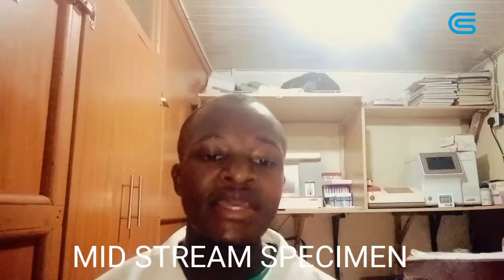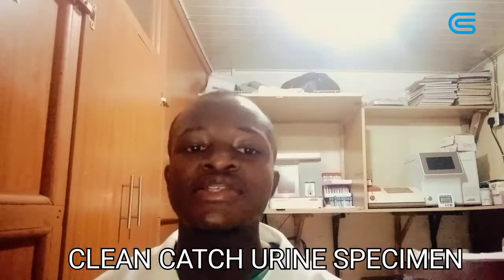So we have the midstream specimen. This is a specimen obtained from the middle part of the first urine. So you urinate first, you stop, you obtain the sample, then you finish. So it will be called midstream urine specimen. It is commonly used for routine urinalysis. It is also important for bacteriological urine culture. So we have also the clean catch urine specimen. It is used for microbial culture and routine analysis.